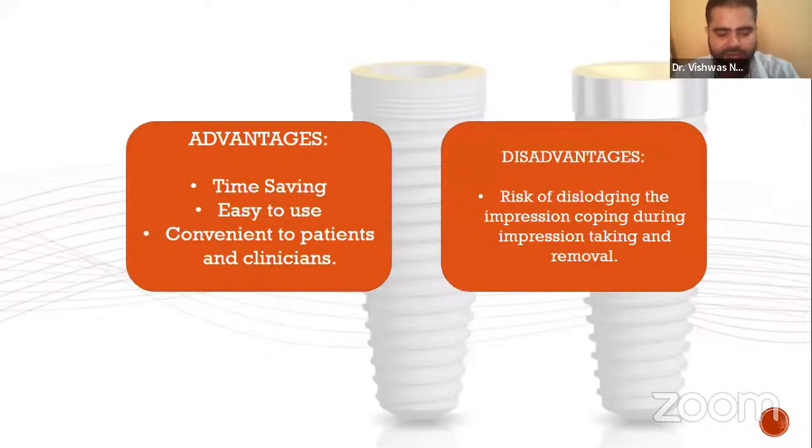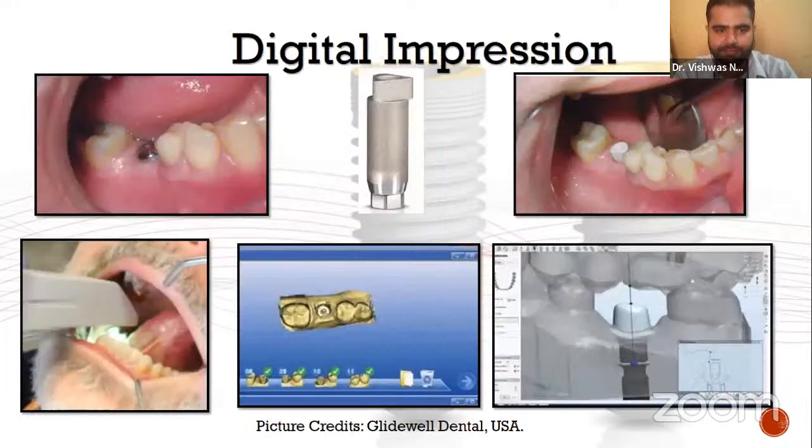The advantage of this technique is that it is time saving, easy to use, and convenient to both patients and clinicians. The disadvantage is that this system can either dislocate or dislodge while making or removing the impression. So it can lead to some problems with accuracy.